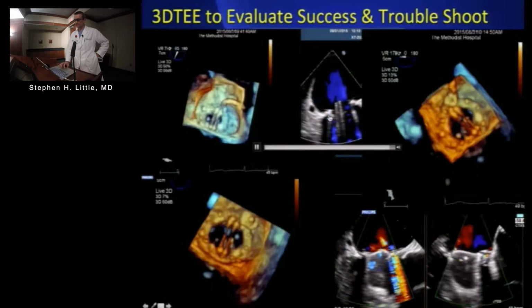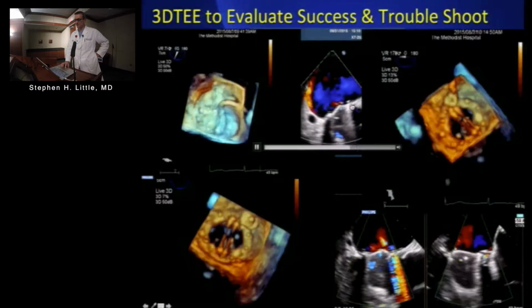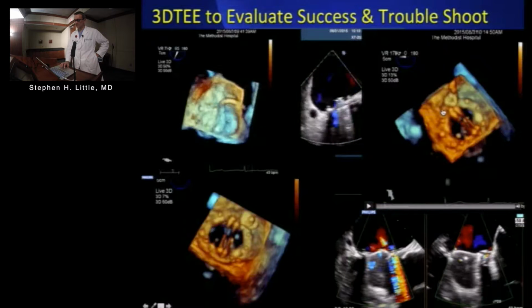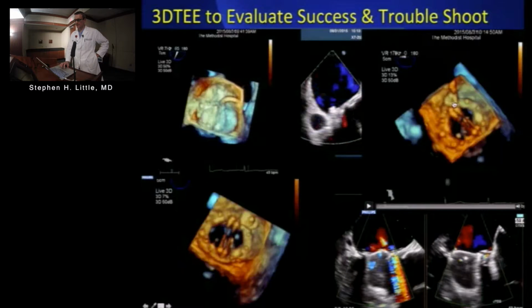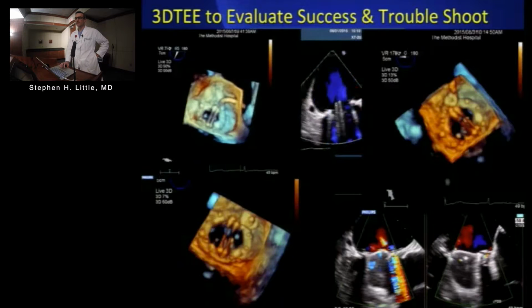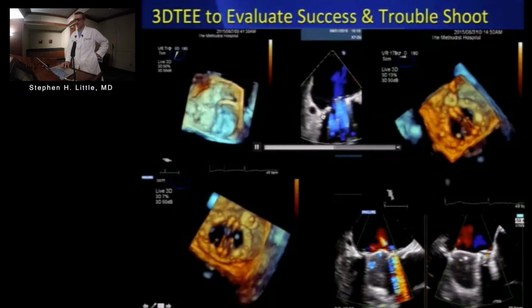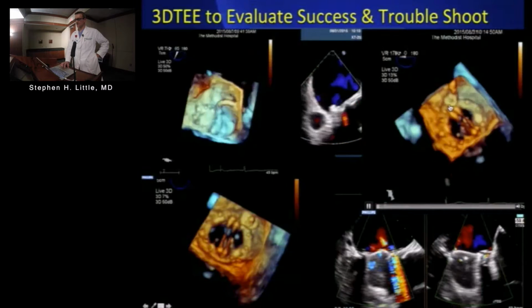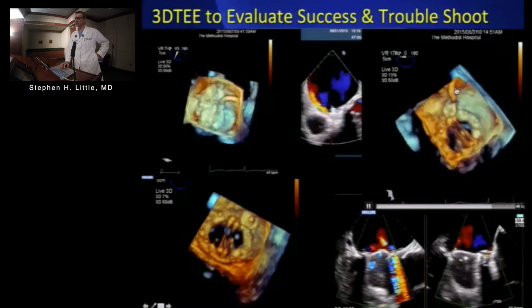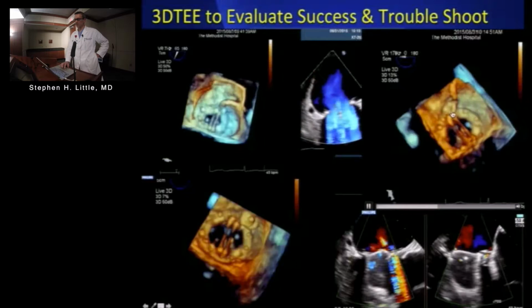There's the defect. We have one device now positioned. So we've now deployed a paravalvular, this is actually an ASD designed occluder, but it fits very nicely in this paravalvular space. But this is actually occluded, and this color is actually the result after this is in. So we have still a catheter. There's a wire there. A device has been deployed.